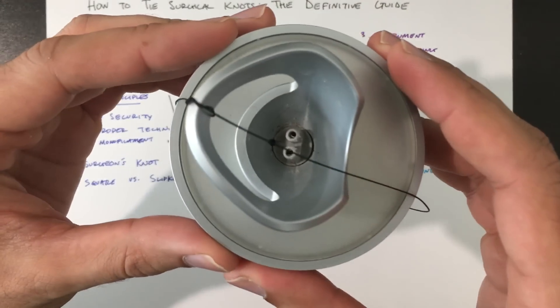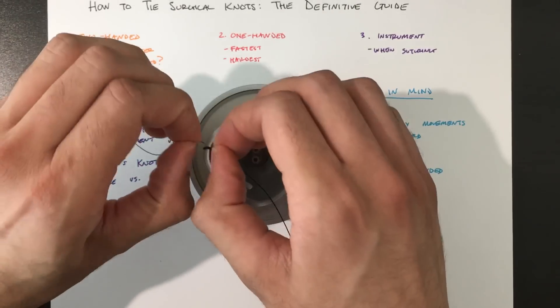As you can see, that's a surgeon's knot, that's two loops, so let me show you that one more time.